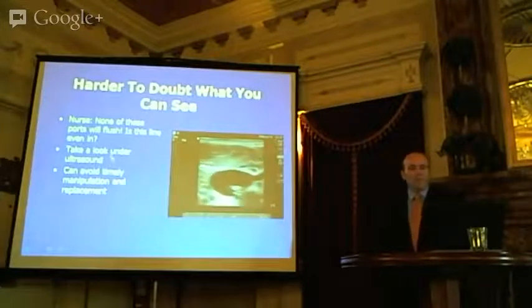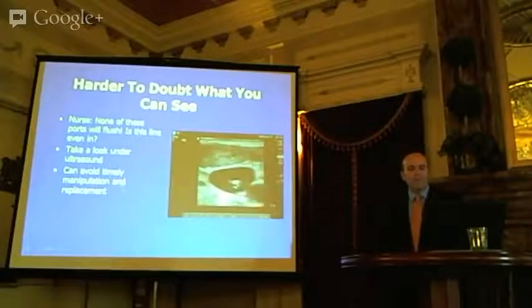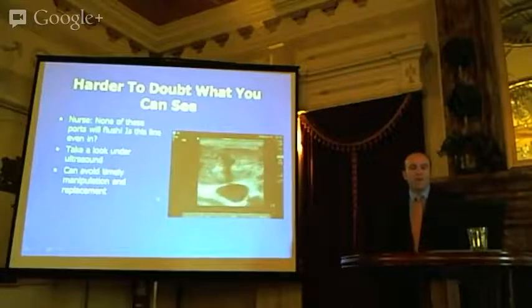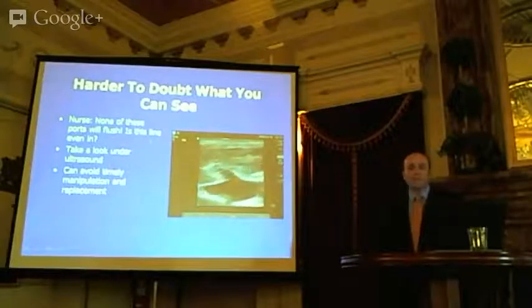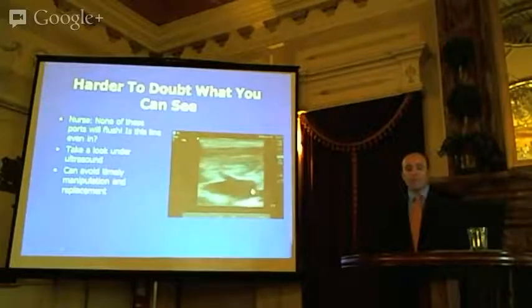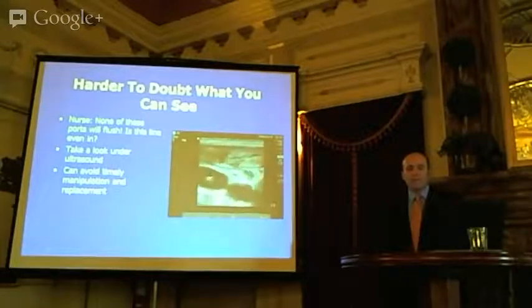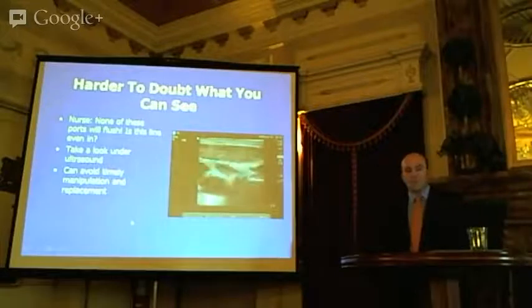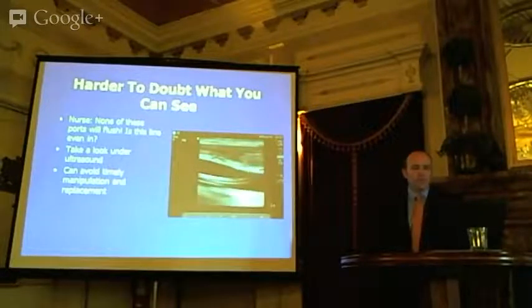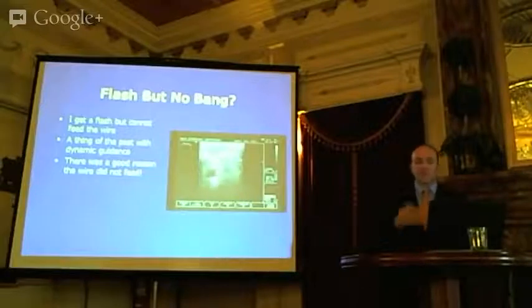This is a great one. This still happens to me all the time. The nurse comes to me and says, you know, you're an idiot, you can't place lines or anything. We all know that. You put this line in and it won't flush. Well, I don't think it's even in. You can actually prove to yourself that the line is incorrectly placed. You can trace it, and obviously if you have to, you can pull it all the way back and make sure the tip is free of obstruction. That's really what you need. It's usually if you're up against the wall.